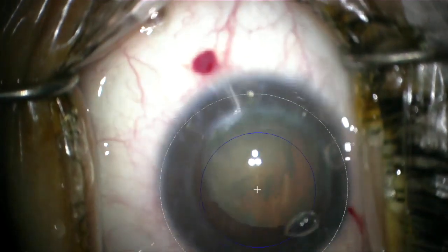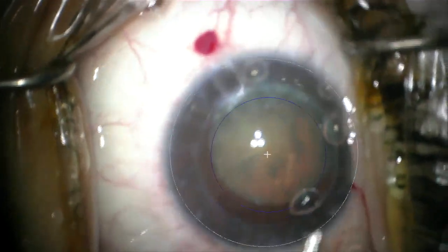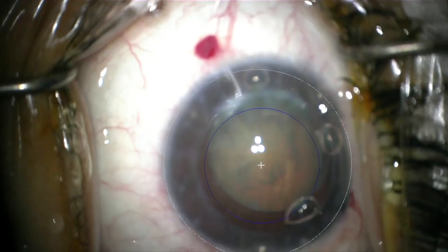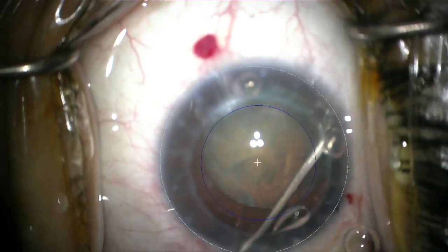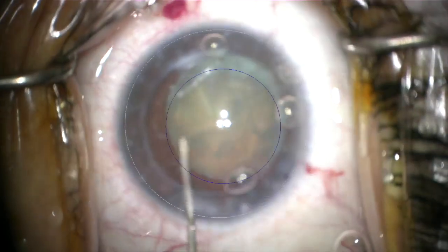I've removed some of the viscoelastic, and then perform a gentle hydrodissection and tapping back the nucleus.